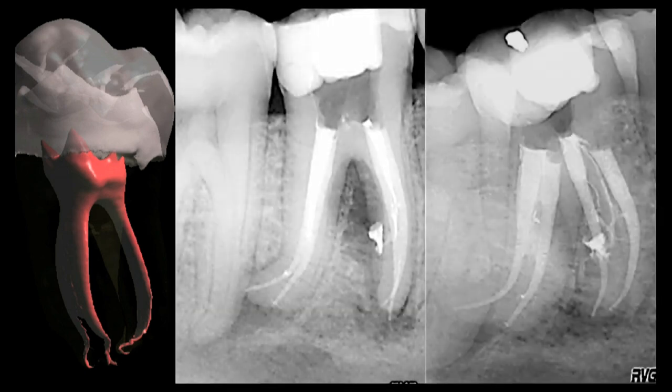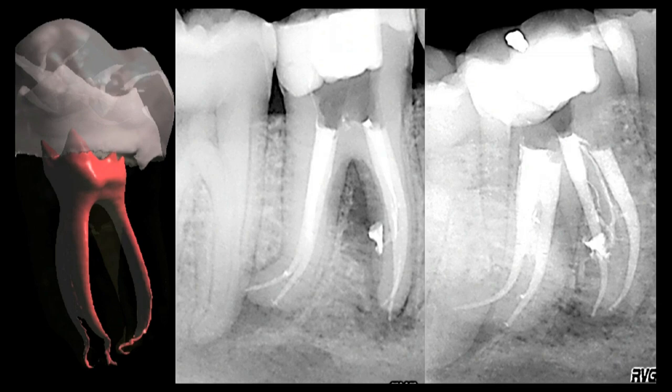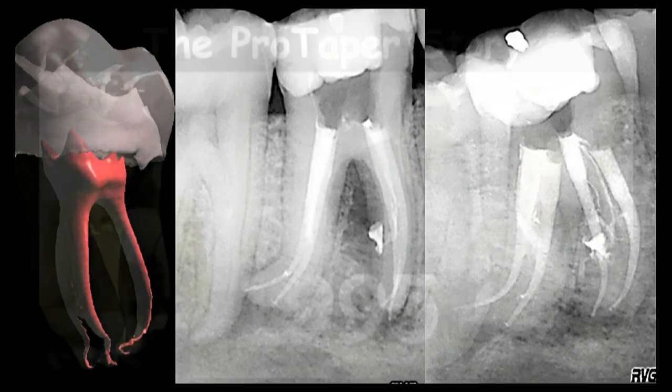And so we know that these anatomies are complex in terms of the tooth atlas. We've seen this before. And can we make technologies that allow us to duplicate nature's anatomy? And the answer is yes.